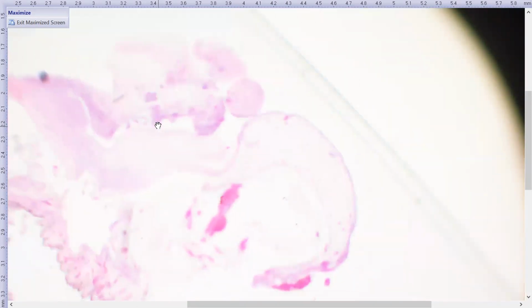Go back to this really distorted eye of cats. So let me try to orient it a little bit more like it was in the gross image. Like so. And this is that translucent, sort of light brown, almost gelatinous looking tissue that was kind of curling around. Here is that clear gap.